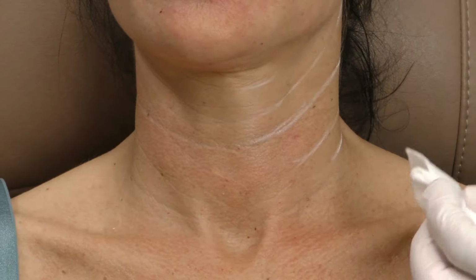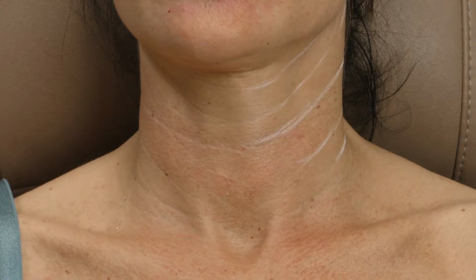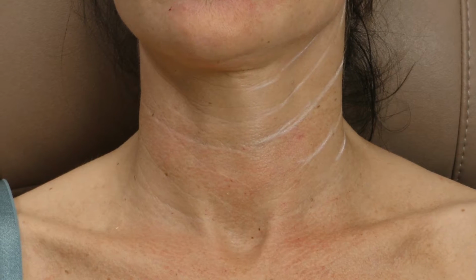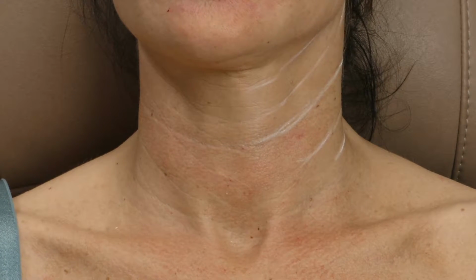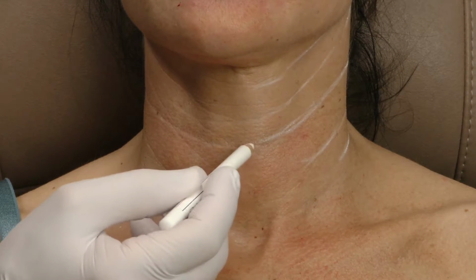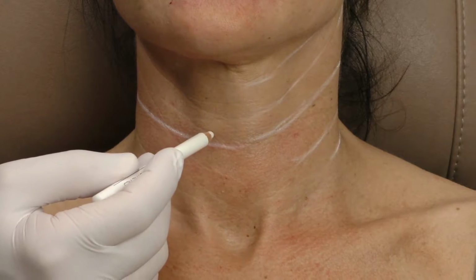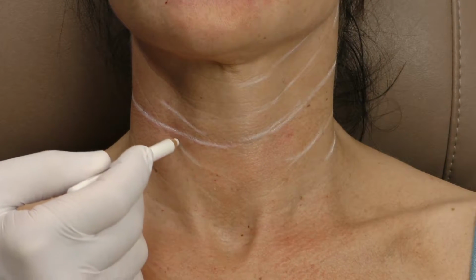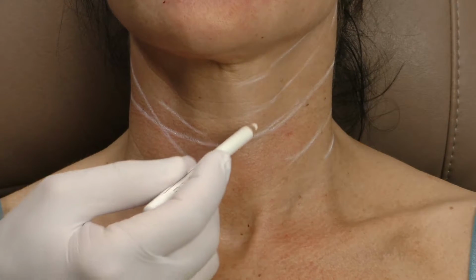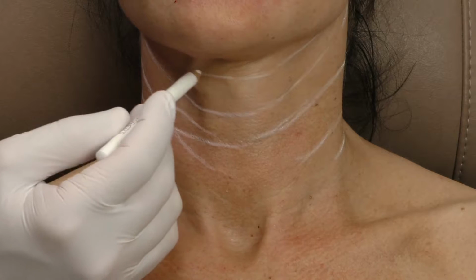And so what we're going to do is use a 50-50 dilution of calcium hydroxyapatite because it's a very thin skin. And then we have a product that has still a little bit of viscosity left, but it's fluid enough for us to be able to even it out properly with some manual massage after the treatment.